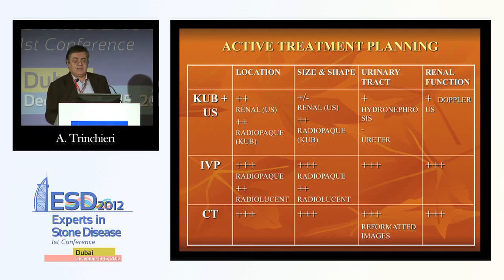So you can use this option only if you have a previous imaging by IVP or computed tomography for a precedent episode of stone disease, and if the stone that you have to treat is very simple.